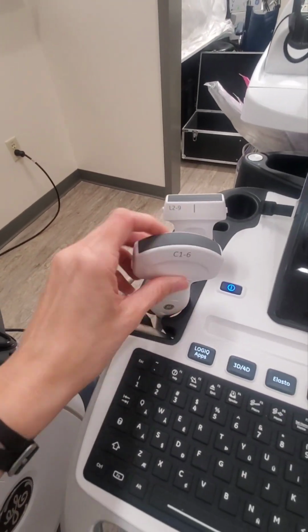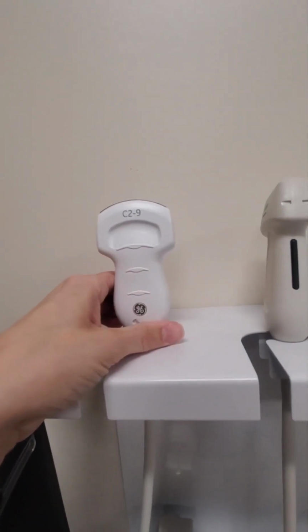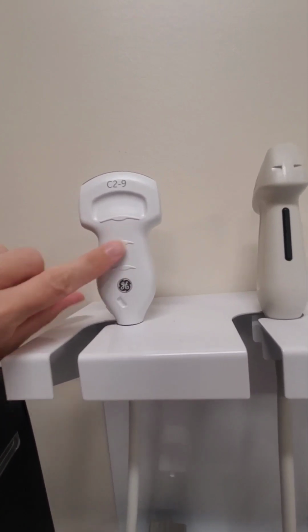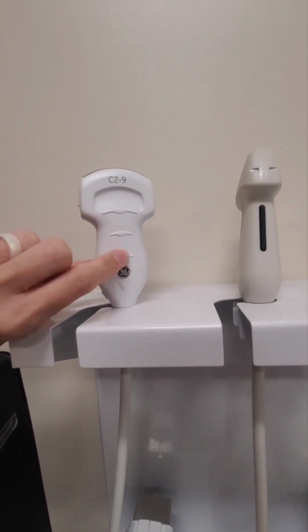So like I said, higher frequency, you're going to be scanning more superficially. It has a smaller footprint, so it's going to be a smaller area that it covers. So this is really good for pediatric abdominal scanning and some really skinny, thin patients.